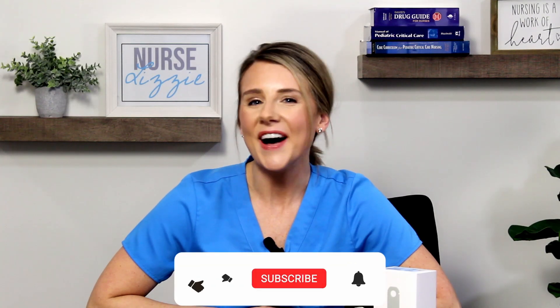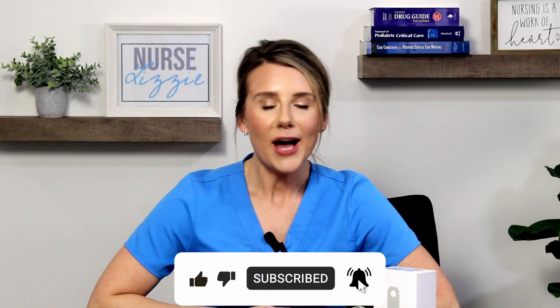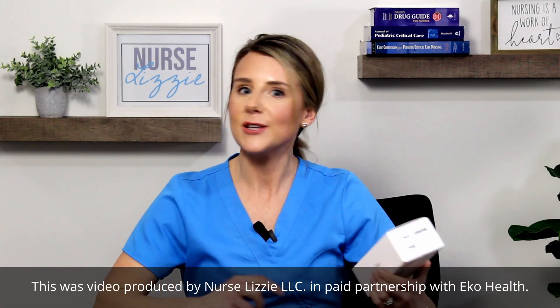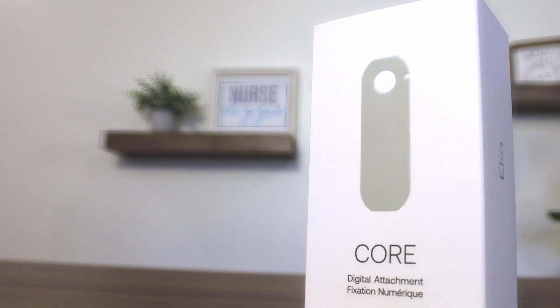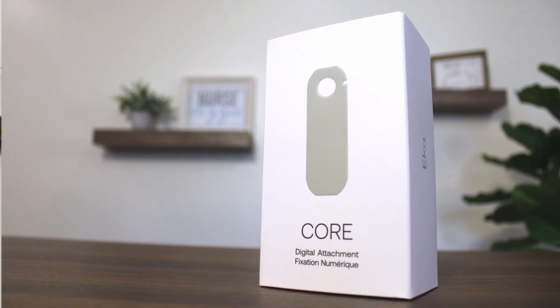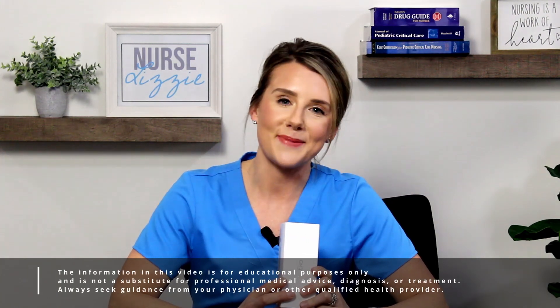Hey friends, welcome back to the channel. I'm Nurse Lizzie. I am super excited for today's video. Eko Health was kind enough to send me some products to find out what all the hype is about. So today I'm going to be doing an unboxing with you and find out more about this Eko Core digital attachment. It's my understanding that we can take this and turn our regular analog stethoscope into a digital stethoscope. How cool is that?